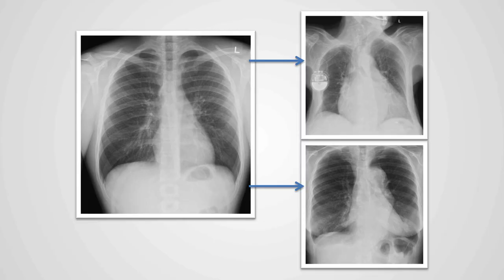The gray scale of a structure can stay the same, but the structure can increase or decrease in size. Here we have an example of a normal. If we focus on the central structures, we can see the normal appearance of the heart. In this example, we see that the heart is grossly enlarged.